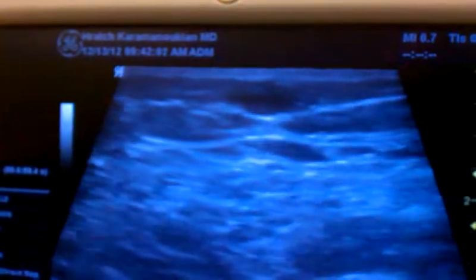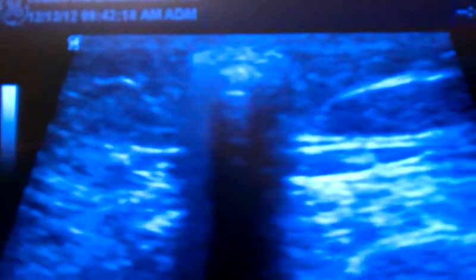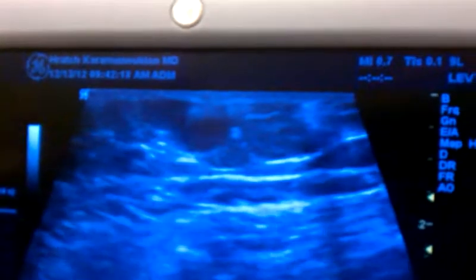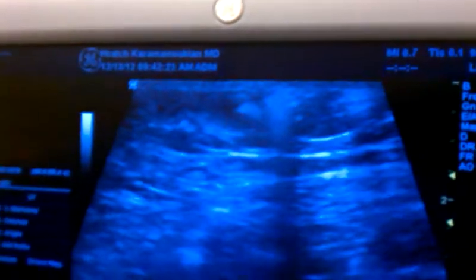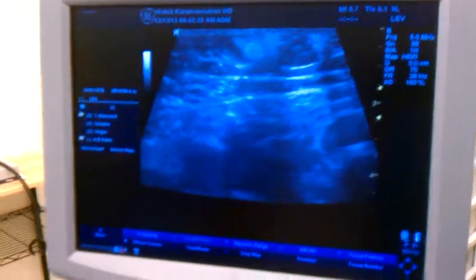And this is another vein we're going to inject here. Here's the needle coming in. Having a really good ultrasound Doppler machine is very important to visualize these things. Those portable machines are not good. This is a P5 General Electric ultrasound machine. Just zoom in here so they can see.